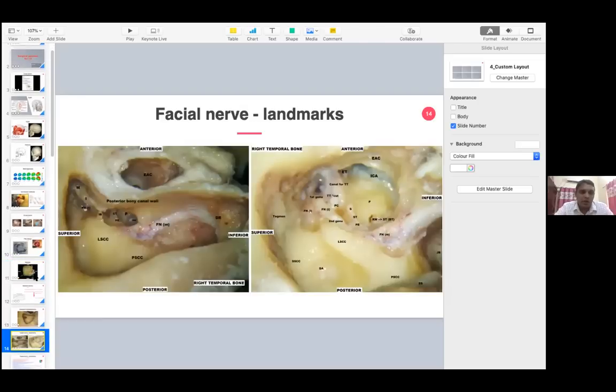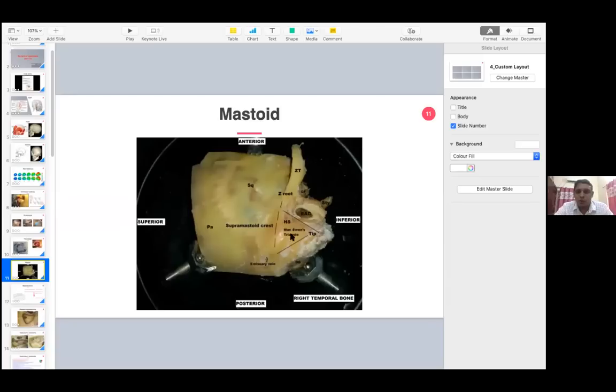In the Varia technique, instead of opening the entire mastoid, we do a suprameatal well. Supra means above, meatus means external auditory meatus. From that area, you enter the middle ear by drilling a small tunnel-like thing parallel to the posterior superior portion of the bony external auditory canal after elevating the tympanomeatal flap.